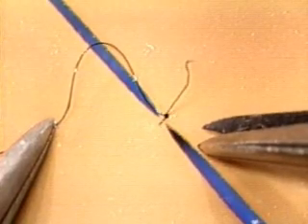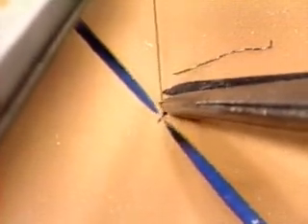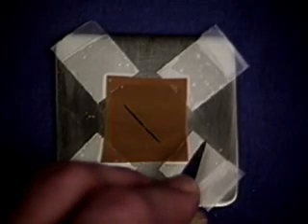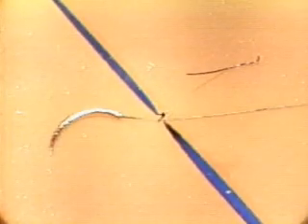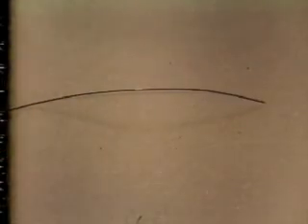To get ready for your next stitch, cut the short end first, then the long end, and then pull on the long end to bring your needle back into view. Then, finally, let go the thread.